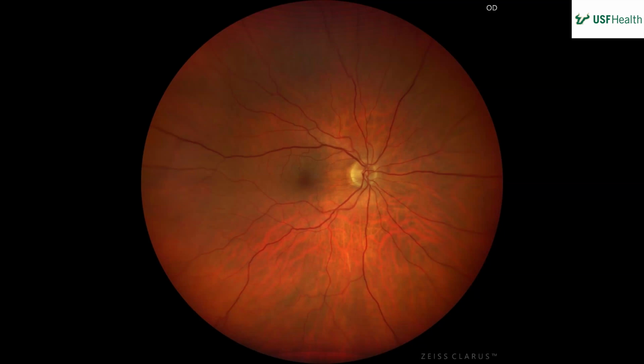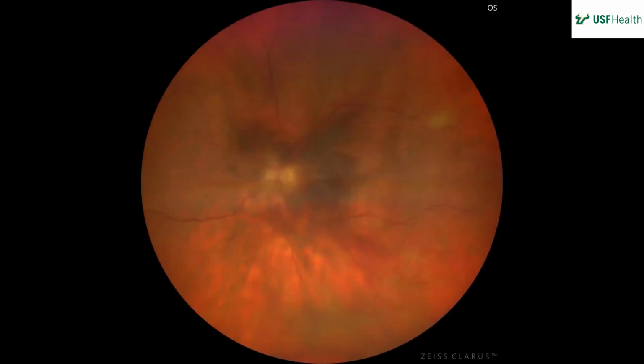And the macula looks normal, foveal reflex. I don't see any exudates, any drusen. Everything looks pretty good, at least from what I'm seeing here. Right. Okay. Is there an artifact at the very bottom? Yeah, that's right on my... yeah.